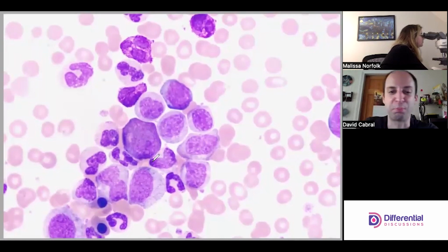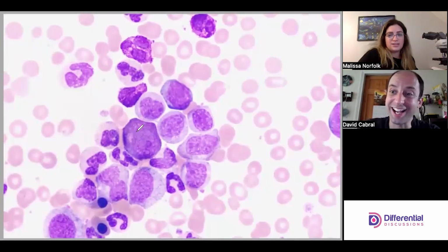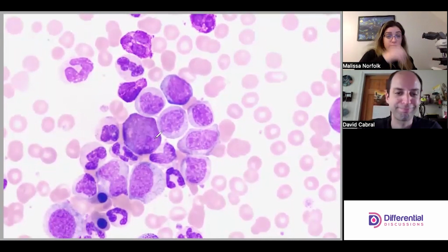My gut instinct was pro, but it's hard to see. You know what though? I think he's an immature eosinophil. Oh, no kidding. I see it now, the myelocytic stage. Yeah, even though he still has a nucleoli. Wow. So this one guy fooled me, some nuclear cytoplasmic asynchrony. That one fooled me, I'll be totally honest. Yeah. No, looking at him briefly, I came over here because I thought he was a really good looking pro, and then I was like, wait a second. That's cool.